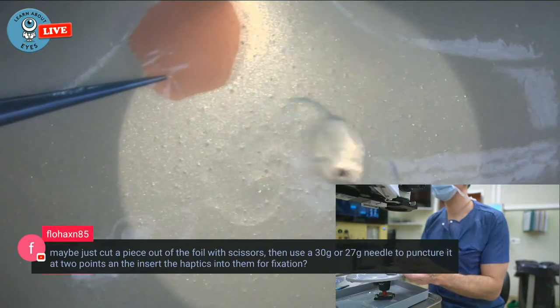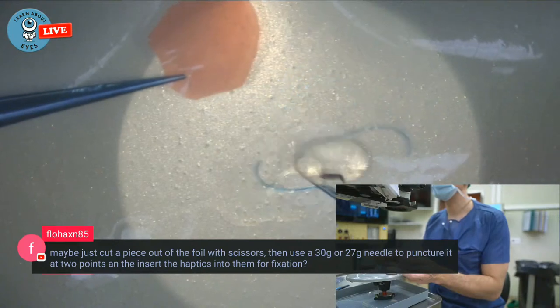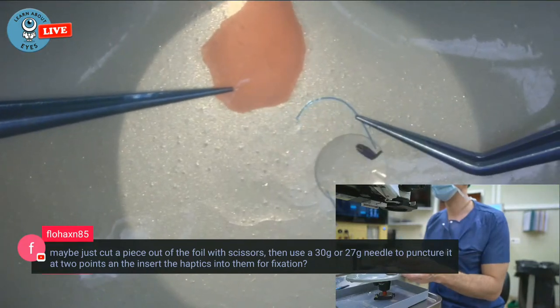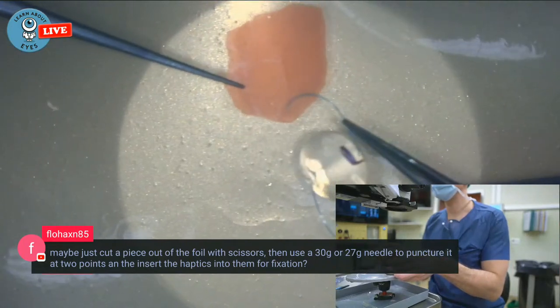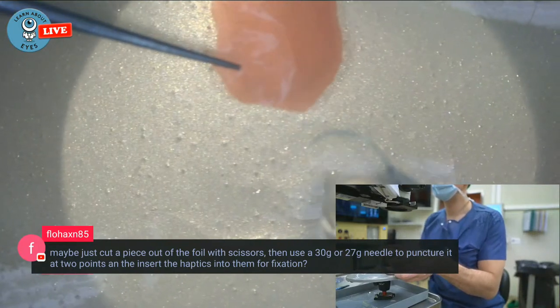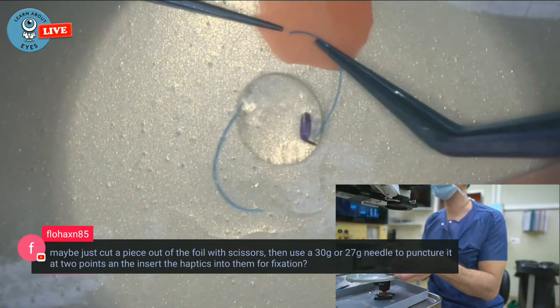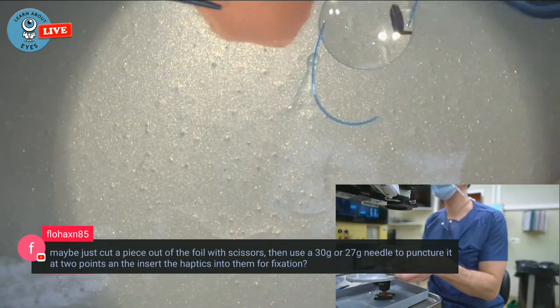Again, this is the way it's supposed to be in, so we need this side to be on top, so it needs to be like this. Oh, I can't really see, is my hole too small here? That doesn't really work. I should have created a bigger punch. See, that's how you learn.